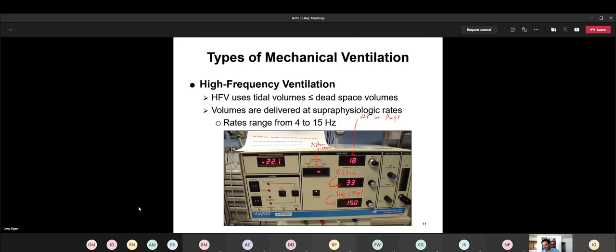And then it says here, adjust bias flow dependent, which means that there are two settings here, and if you change one, it might affect the other. And then right here, there's the knob. So adjust with this and this right here.